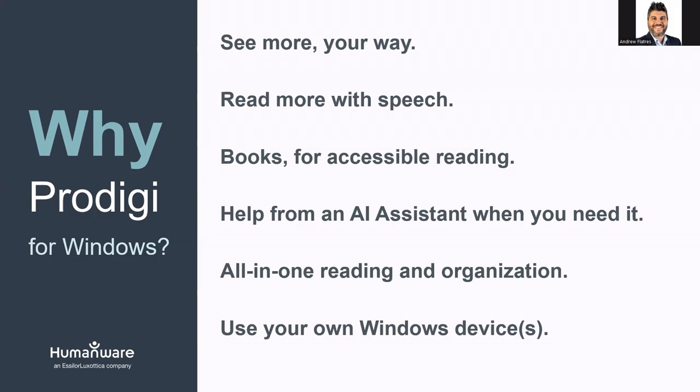So again, hopefully I'll do a good job of giving you a gist of what it's about while highlighting what's new in version 1.5. Looks like about 27% have done a trial or demonstrated the software, and 13 out of 33, or 39%, said that they use the software. So those results should be shared, or will be shared, very briefly.